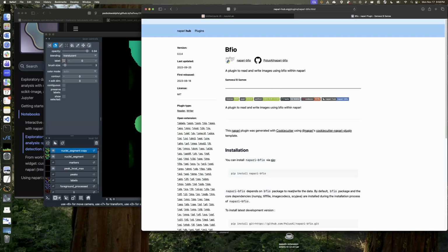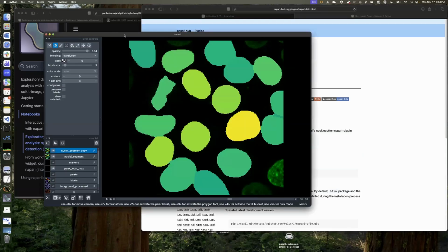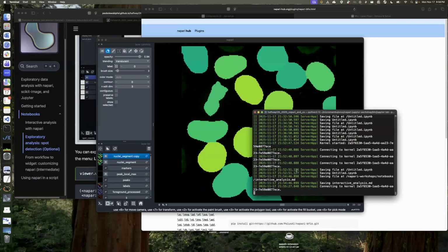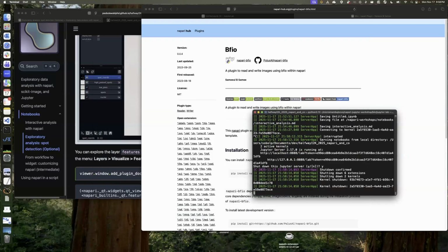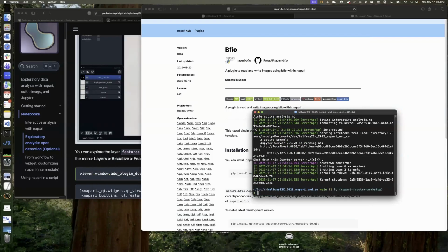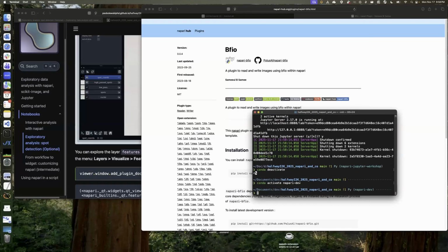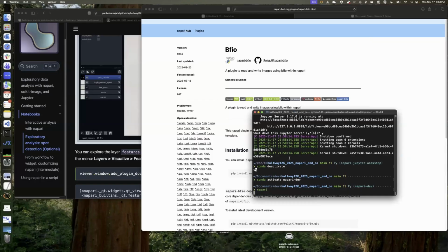How well does Napari perform with huge files? So it depends on the kind of file. I can show you real quick. For example, the kind of files that I work with most commonly are pyramidal, from a slide scanner.